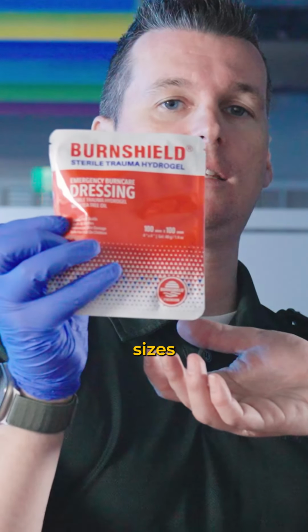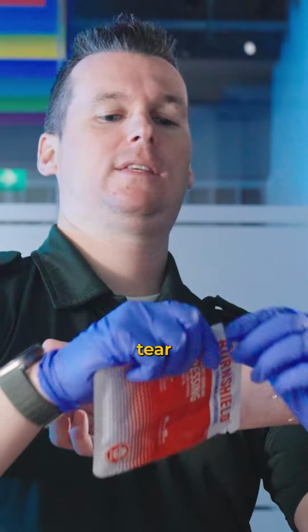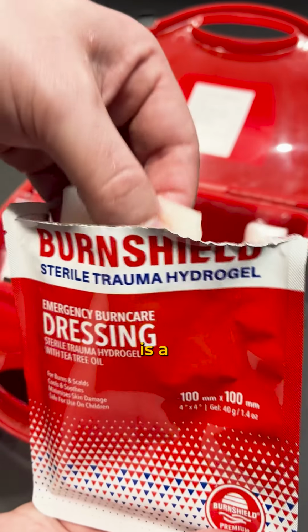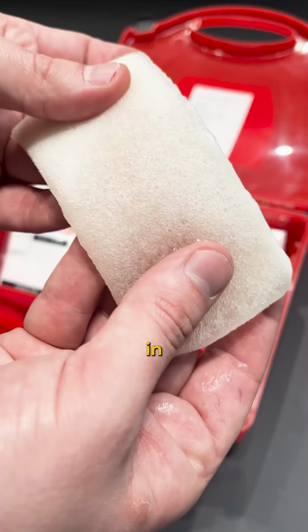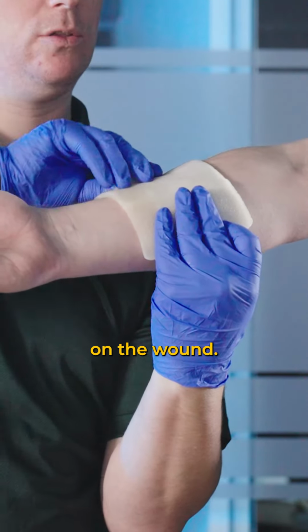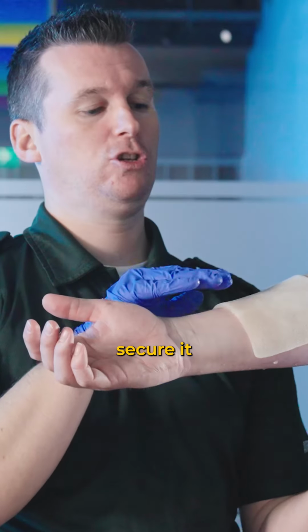So there are different sizes of burns dressings. For this one, because it's a forearm, I've chose this side. So tear off the top of the burns dressing, and inside is a dressing that is soaked in a gel. This is sterile, so it can be placed directly on the wound, and this can now be covered with a bandage or cling film to secure it in place.